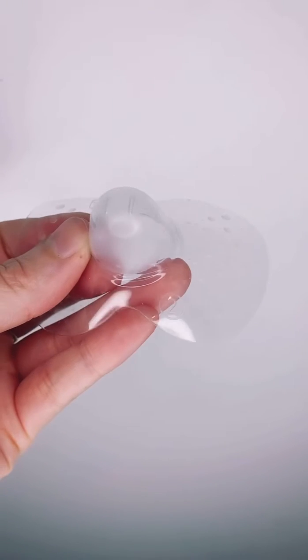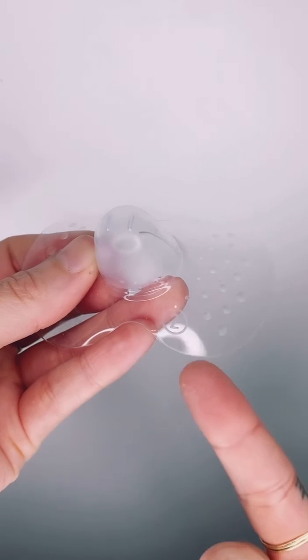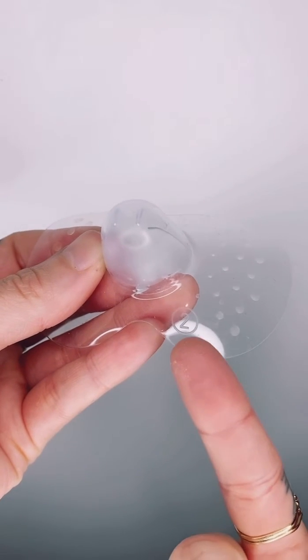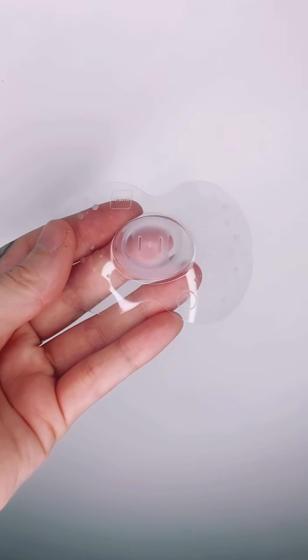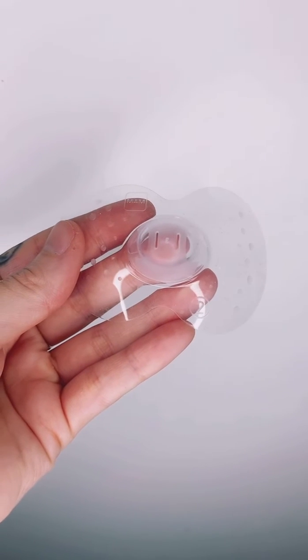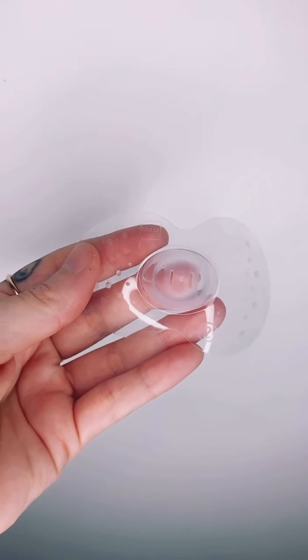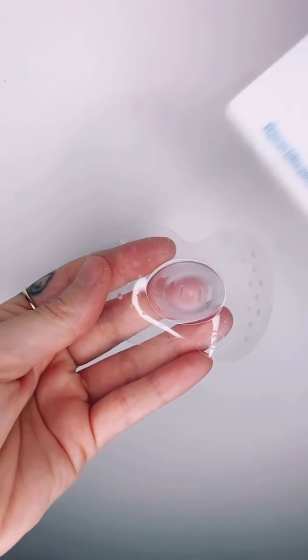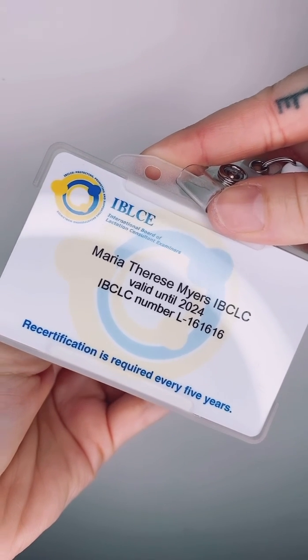The shields also come in different sizes, and it is important to pick the right size so your baby can actually latch onto them. Nipple shields do not have a preferred time of usage, so that means you can use them for as short or as long as you want. The only thing that I always recommend is work with your IBCLC to fully figure everything out.